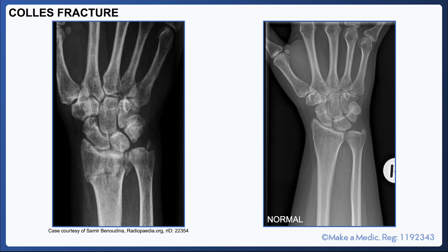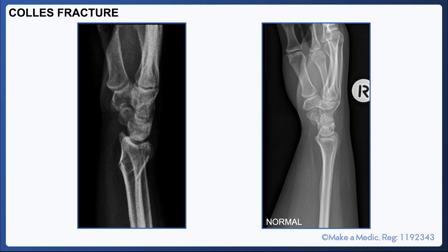On the left is the x-ray of a patient with a Colles' fracture. This is a fracture of the distal radius that usually happens after a fall onto an outstretched hand. It results in dorsal angulation and impaction of the distal fracture component. In this example, you can see that the radial contour is no longer smooth, and that there is a loss of radial height. On the lateral view, you can see that the head of the radius has been dorsally displaced.